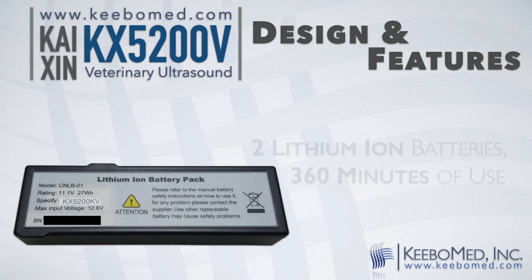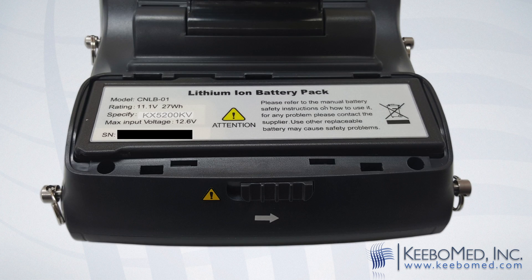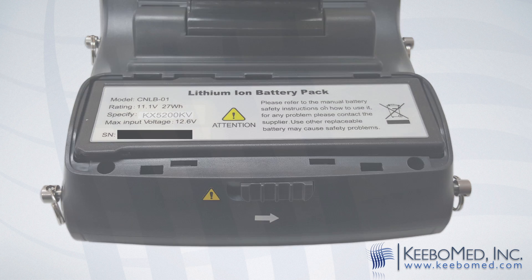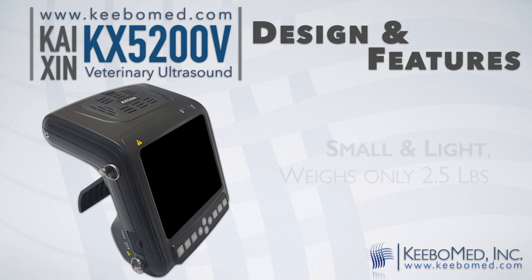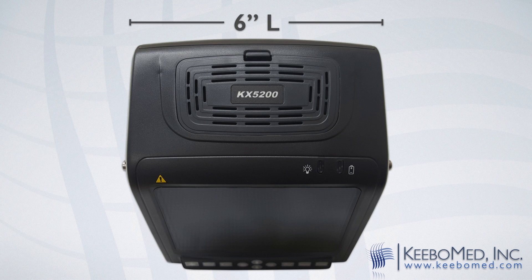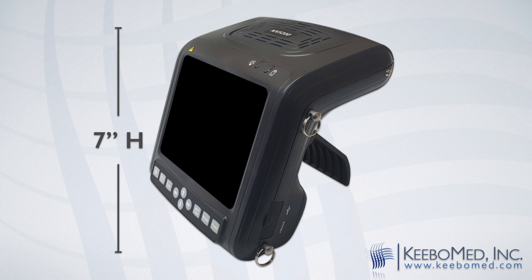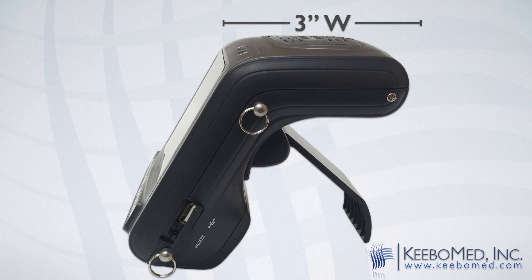It includes two high-capacity lithium-ion batteries to ensure about 360 minutes of use. The battery can be easily removed by sliding the bottom switch. The main unit weighs two and a half pounds and is approximately six inches in length, seven inches in height, and three inches in width.